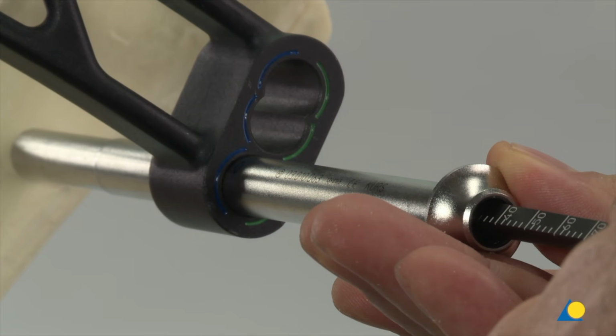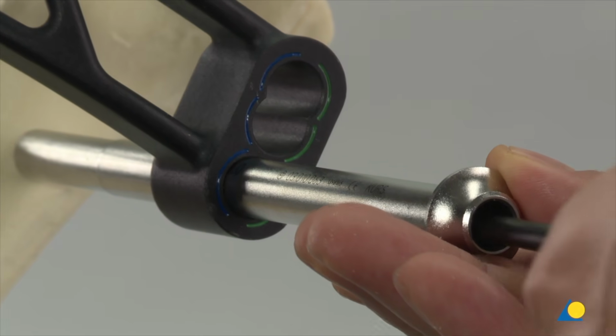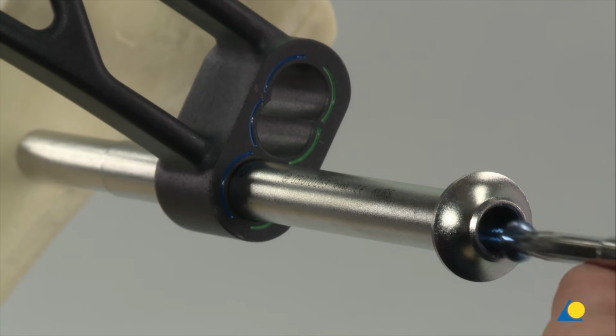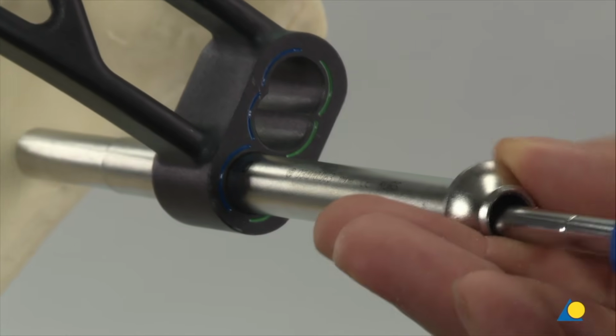The length of the first locking screw is determined by reading the measurement at the back end of the protection sleeve. In this case, 40 mm is measured. The 4.0 locking screw is inserted through the protection sleeve and threaded into the hole with the screwdriver star drive T25.